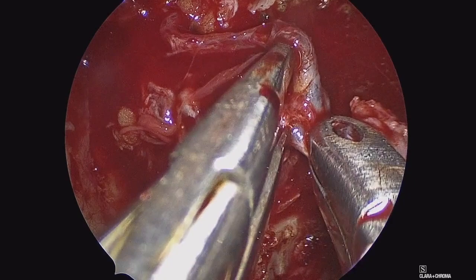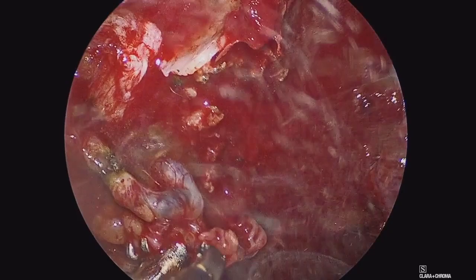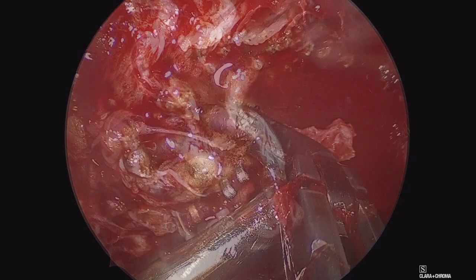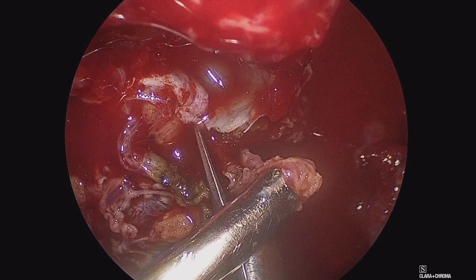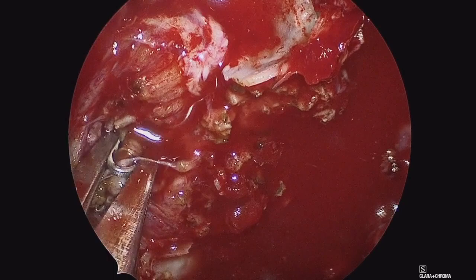We'll then transect the internal maxillary artery and remove the last portion of tumor within the pterygopalatine fossa. For added measure, we're coagulating that with a bipolar cautery, then working through that artery and dissecting the tumor from the infratemporal fossa and PPF in towards the nasal cavity. Here we are just lateral to the last portion of tumor, trimming and removing it. As we all hate to get postoperative epistaxis — which could be life-threatening in this case — we'll put a few extra clips and cautery on that particular artery, which has been previously embolized.